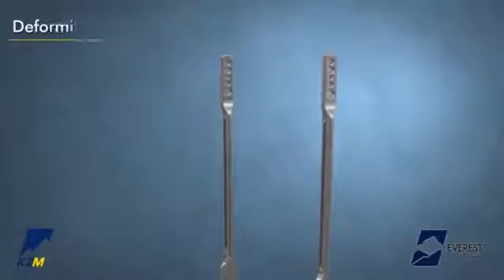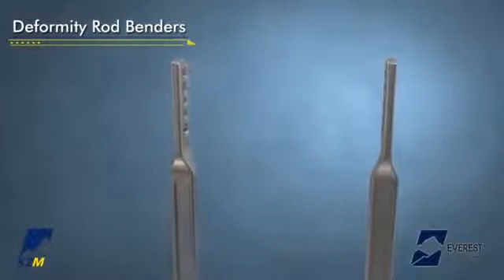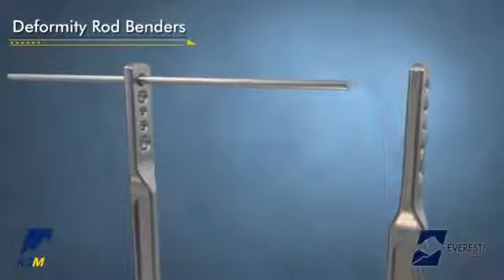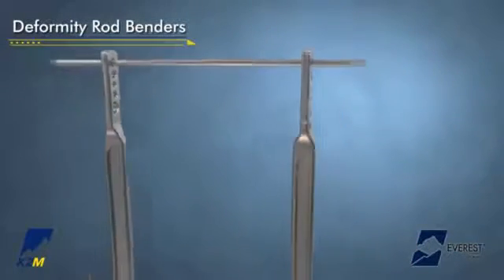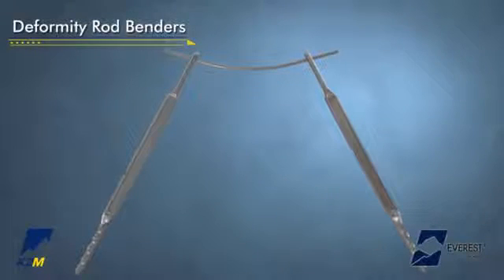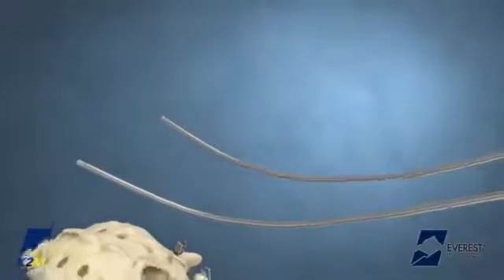The deformity rod benders may be used to contour the rod into the desired sagittal and/or coronal plane. Insert the rod into the appropriate hole and support the inserted rod by applying pressure while inserting the rod into the opposite bender. Use the distal portion of the benders for optimal mechanical advantage. The rod is then bent to the desired contour as determined by the surgeon. Once the rods are contoured into the desired shape, gently place rods into the heads of the screw.